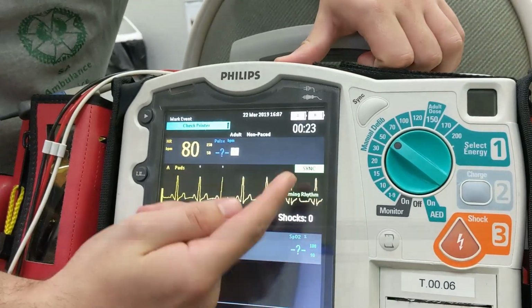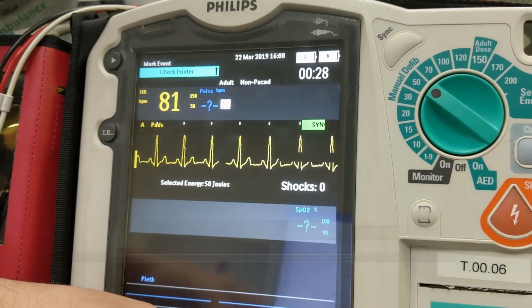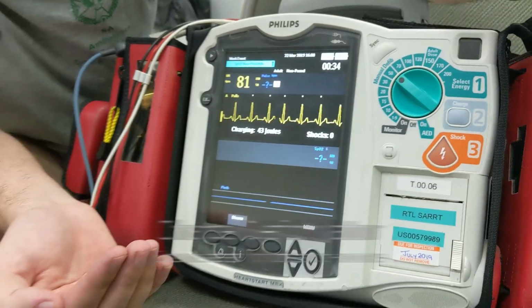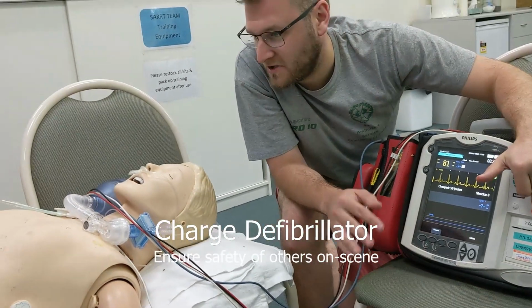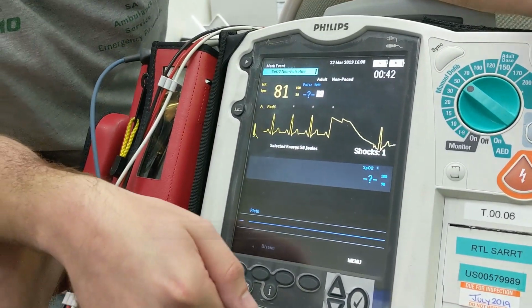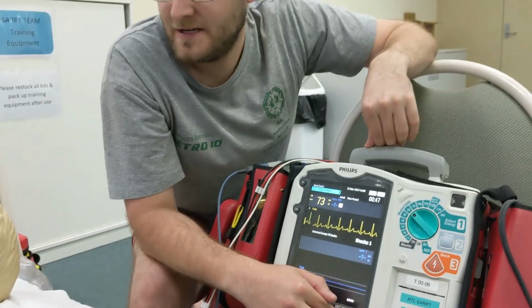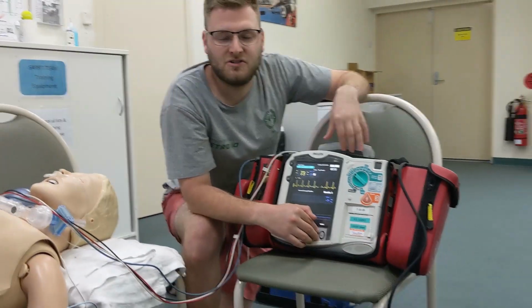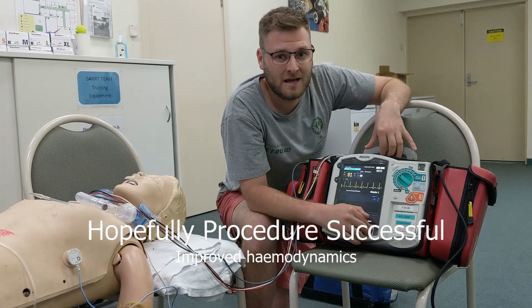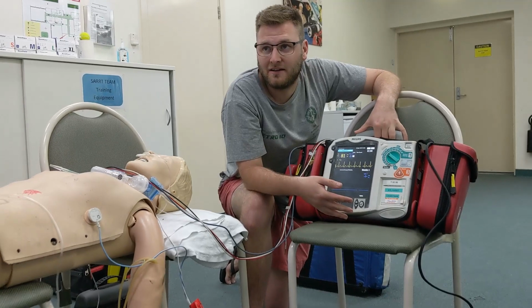By pushing the sync button, we should then get a flashing sync light and then markers with each R wave of the QRS complex to indicate that the machine has appropriately identified the QRS complex. We're going to charge, and then we're going to make sure that everyone is clear and safe and deliver a shock. We're then going to reassess the ECG and the patient's presentation. Hopefully the ECG will have returned to a sinus rhythm, or a rhythm that is more hemodynamically stable. We're going to reassess their observations and their conscious state to see if it's improved.